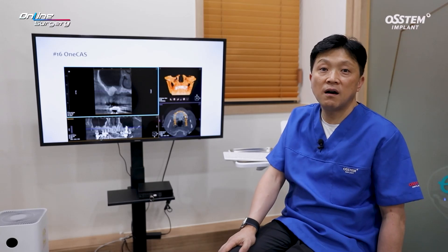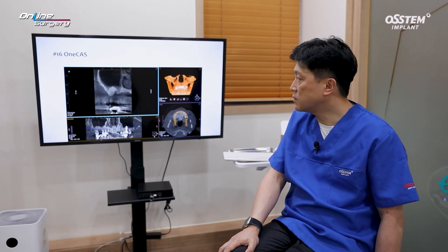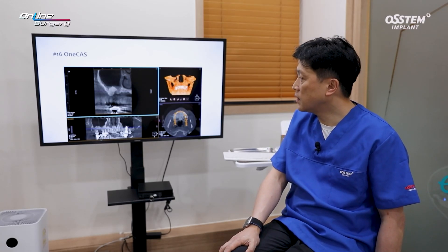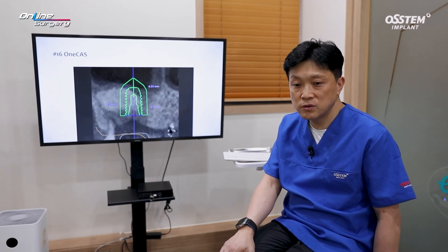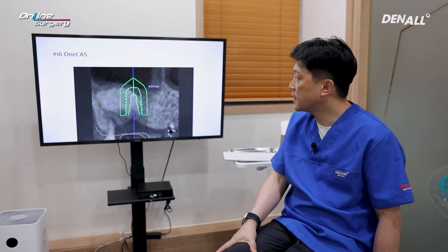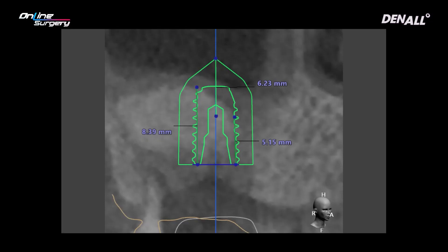The plan was to use one CAS kit for this patient. In the surgical report, when you measure using CT, the implant was positioned virtually. The mesial and distal distances to the sinus differed significantly — the longest distance was 8.39 mm and the shortest was 5.15 mm.